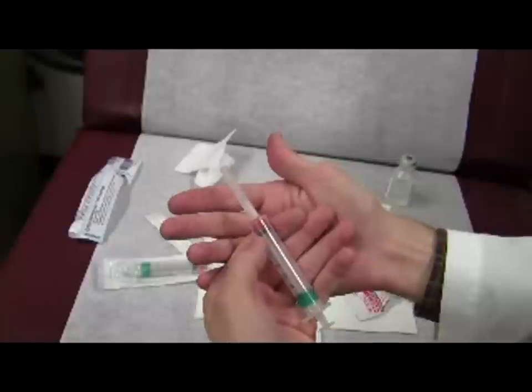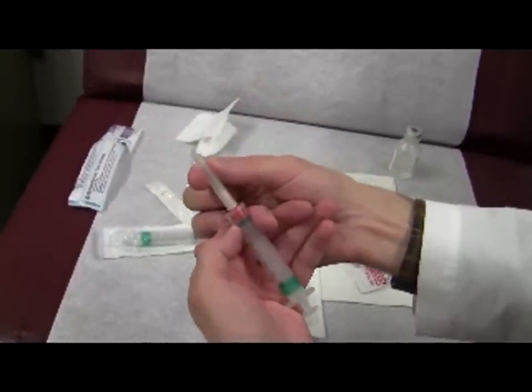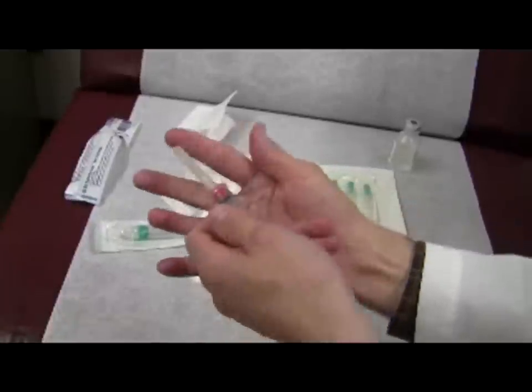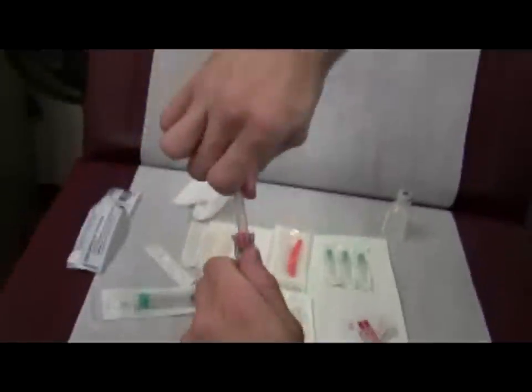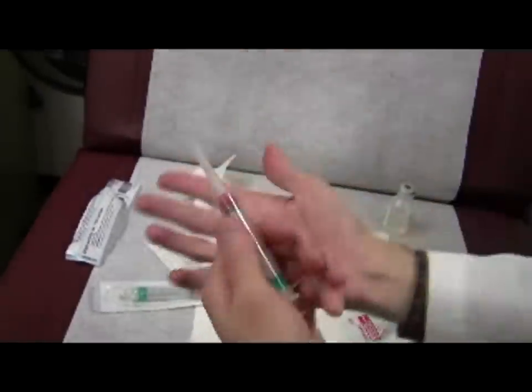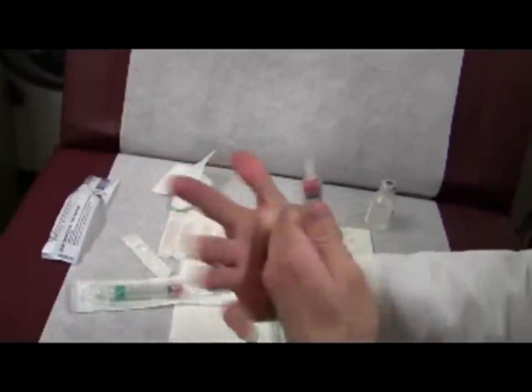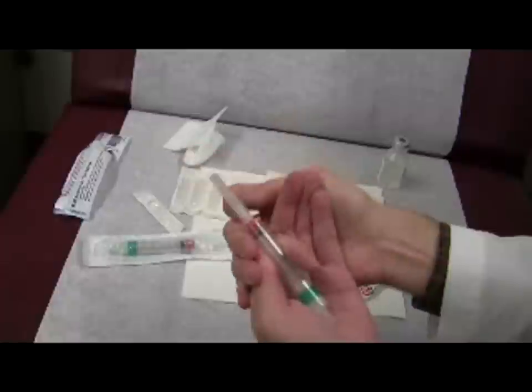Grab the cap of the needle with the right index and thumb, with the right index and thumb pointing in the direction of the needle. The right thumb should be touching the dorsal aspects of the left fingers. Uncap by extending the right thumb and index without displacing the right thumb.